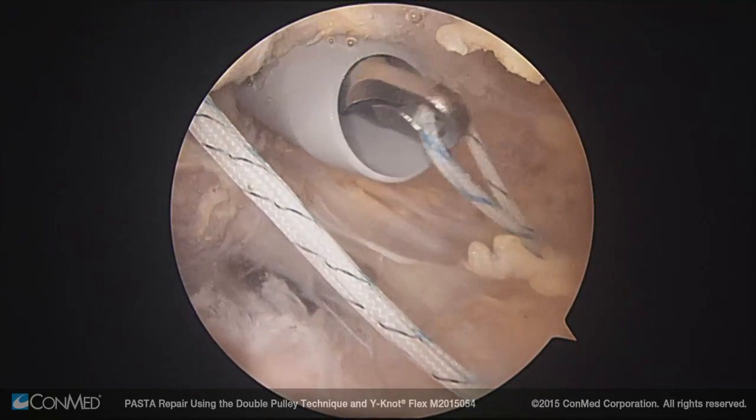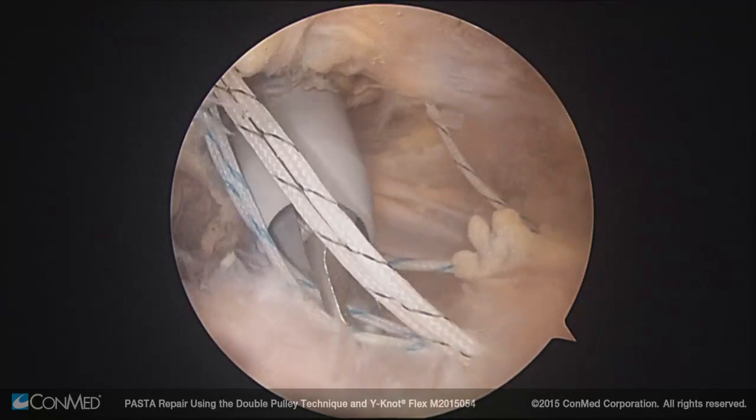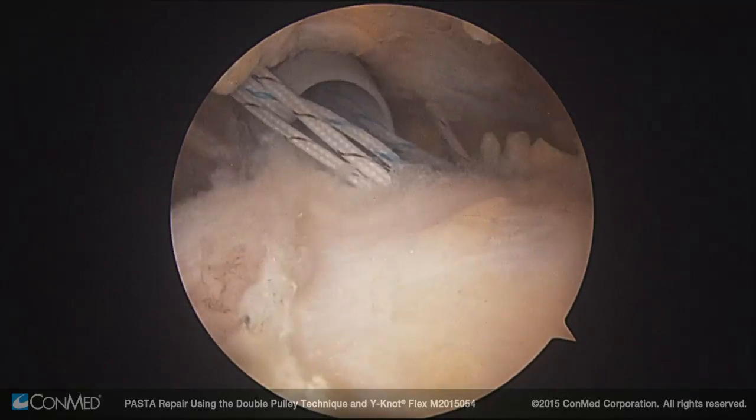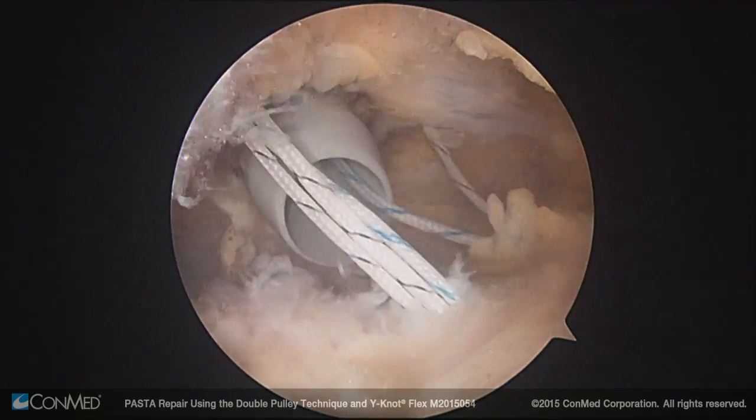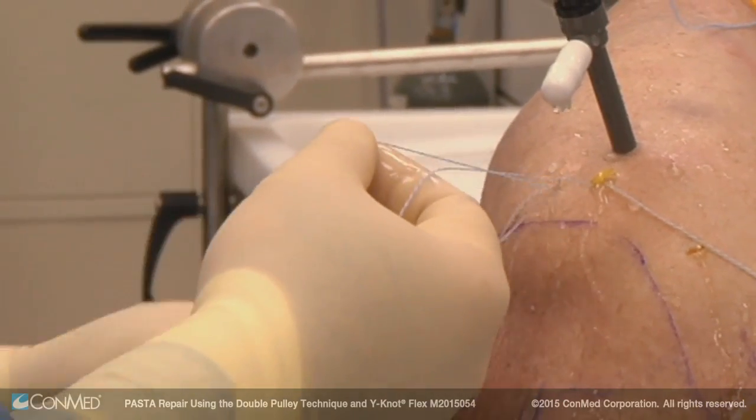To start the double pulley technique, I take one blue-white cobraid suture from the first anchor and one blue-white cobraid suture from the second anchor and pull them through the anterior lateral portal. Once outside the joint, I will tie a mulberry knot and then cut the tails.